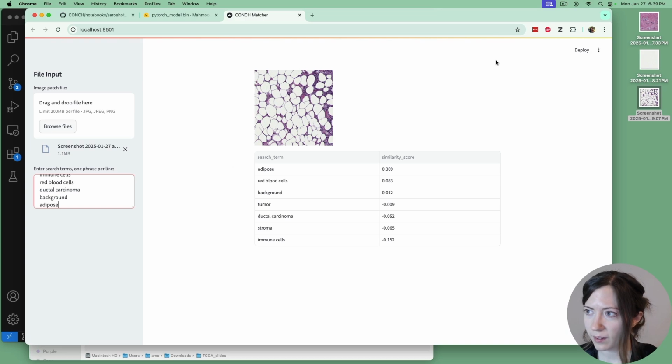I would really love to hear if you guys had ideas of other domains that this sort of thing could be applied to besides histopathology. I'm sure there's a lot of different PubMed publications that have covered those sorts of things, and it might be kind of interesting to see if we can maybe create our own data set using a similar method and train Conch on some other domain.